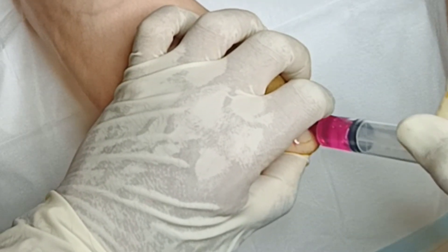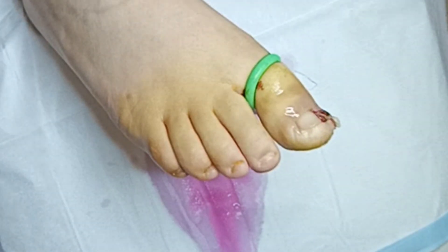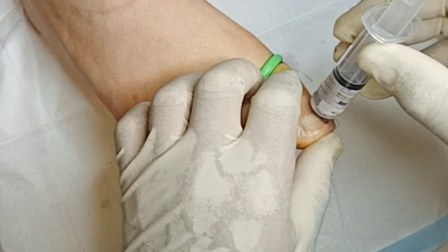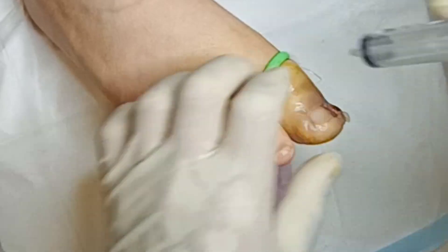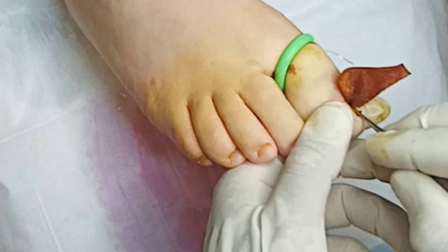We've got the chlorhexidine flush that will neutralize the acid — give a nice flush, make sure that's all clear. Then we'll go into the saline and give everything a nice flush. Most importantly, you've got to take off the tourniquet — you have to remember to take it off. So I get into the habit of saying to the patient, 'Look at me, I am taking it off.'